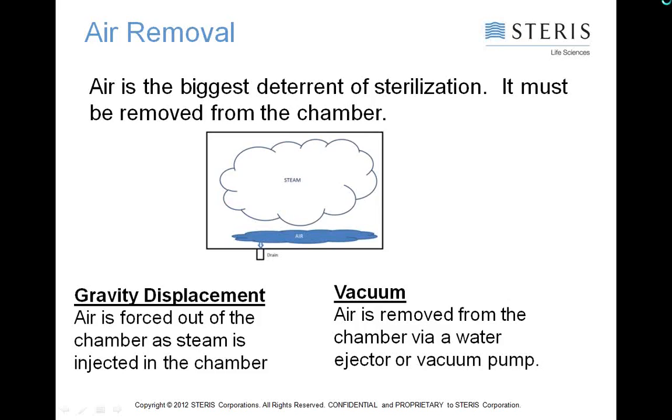And on the opposite side of wet steam would be superheated steam. So here, we've got the appropriate temperature we need, and we've got certainly an increased amount of energy, but the problem is we need the contact, and the contact comes from the moisture. So where you don't have the moisture available in the steam, you're also going to fail to sterilize adequately, or you're going to be not as effective in either of these situations, wet steam or dry steam. What we're looking for is around 97 to 100% saturated steam to be effective.